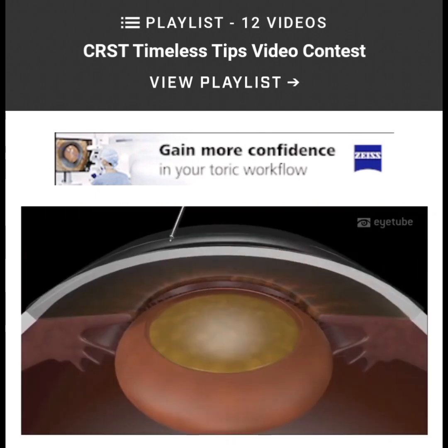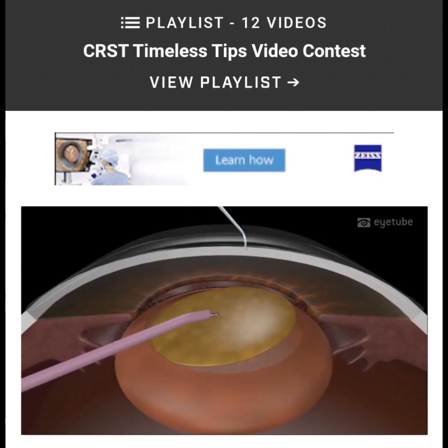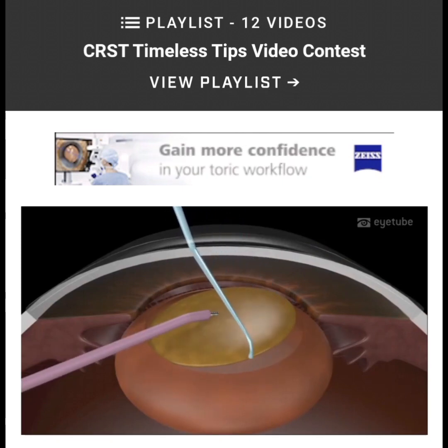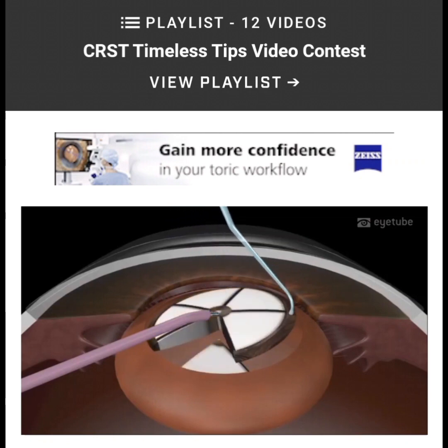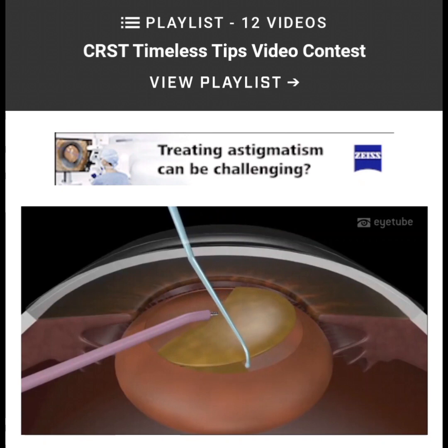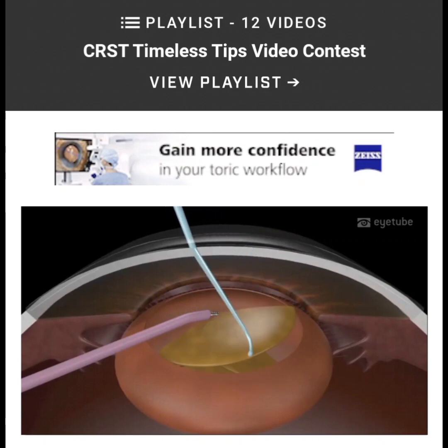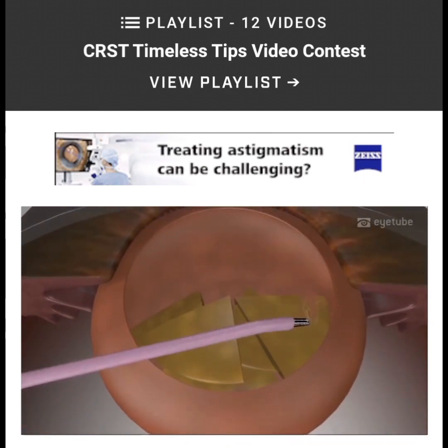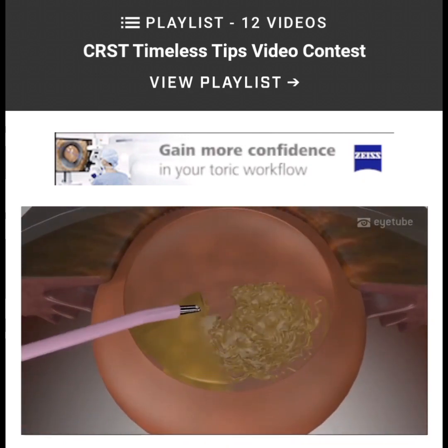After capsulotomy, I try to do a hydro in which the nucleus is popped. Once this is popped, then under vision from the equator, you can draw a straight line to the center where the nucleus is impaled, and you chop this nucleus into pieces like this. You do a supracapsular chop, but you do the emulsification in the back.